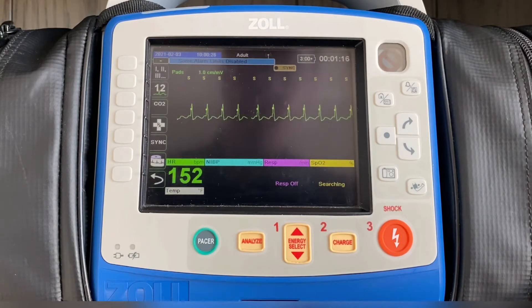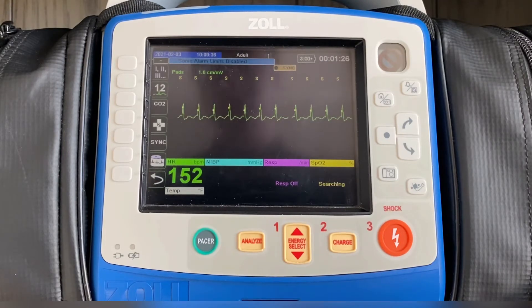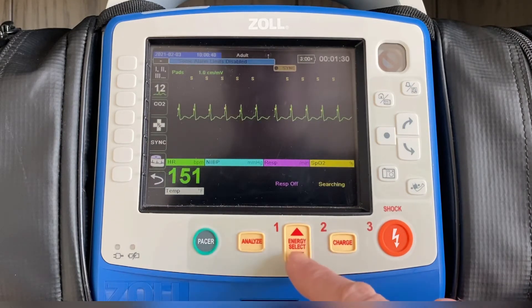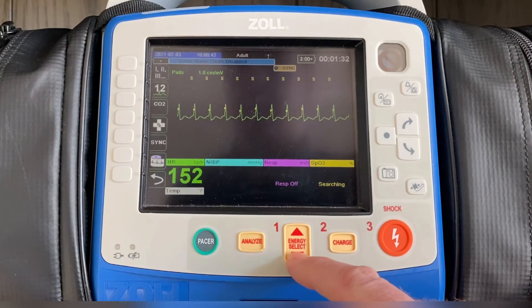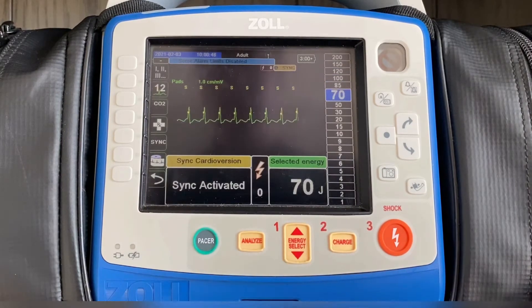Based on your local protocols, that's what's going to dictate the energy level that you start at. A lot of times protocols will say based on manufacturer recommendations — Zoll's manufacturer recommendation is to start at 70 joules. So assuming your device is programmed to start at 120, you're going to press energy select down three times so that 70 is highlighted.